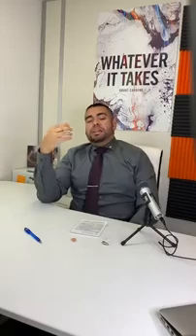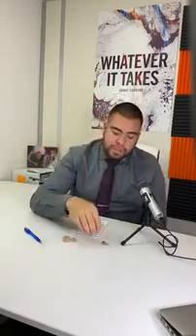So let's get into rechargeability. Now, all custom hearing aids do not have the option for rechargeability, and that is because each hearing aid is custom molded and built to that patient's ear. So they don't have a standard base where they can just be seated or anything like that. Maybe in the future there might be wireless charging, but not as of now. There's not that type of technology for hearing aids yet.